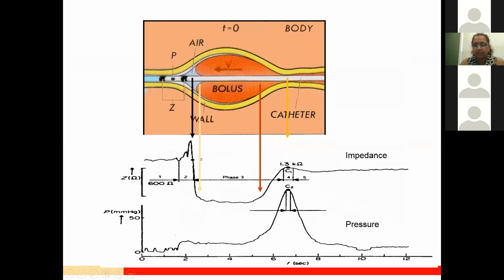Yep. Okay, great. So I think Rob included something like this in his talk, talking about the basics of esophageal motility interpretation. High resolution manometry has really transformed what we can get from traditional manometry, and really helped us to evolve the interpretation of motility disorders.